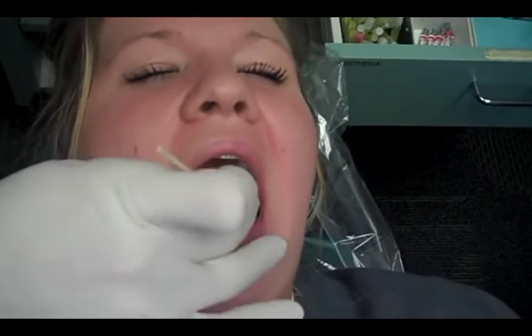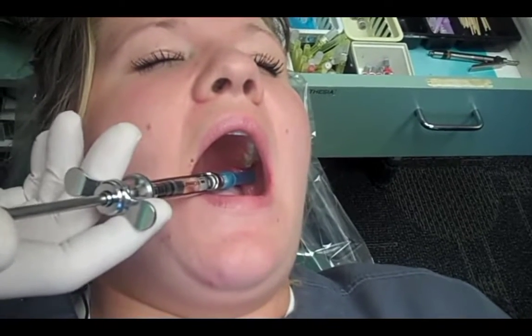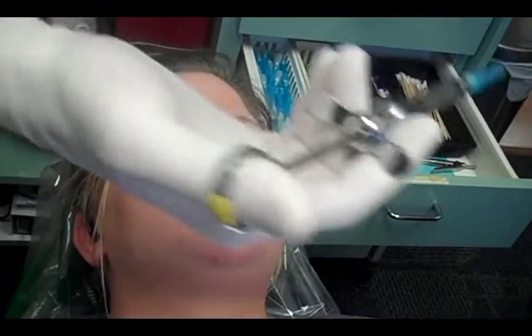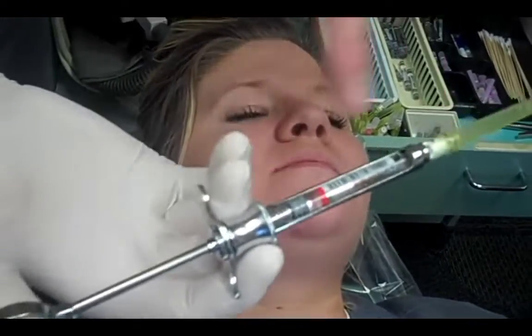If I'm truly giving April a block, I would go in here, take this off, and give her injection, first one right here with the plain and the blue. Now guess what? I screwed up. Why did I screw up? See, that's loose. That would be bad. I would be very mad. So remember, that has to be set there so that there's no give, because when we go in there, we have to pull back to make sure we're not in the blood vessel. So she would get that for the block, and then immediately following, we would do the same thing right back there, that 27 gauge and lidocaine, to give the full block without stinging.